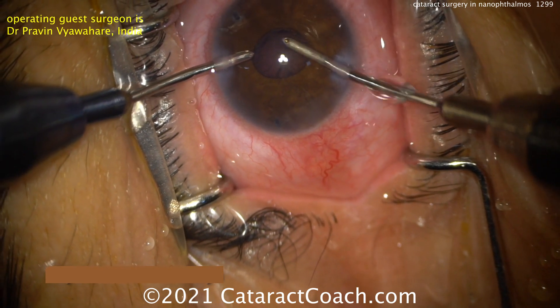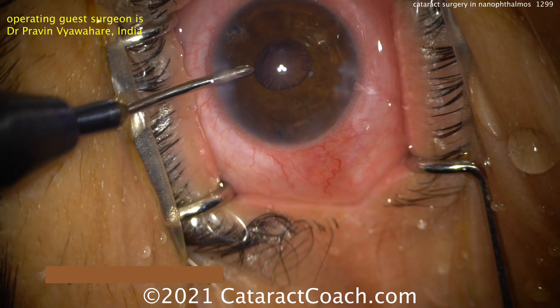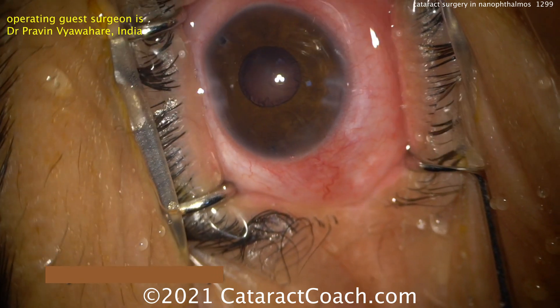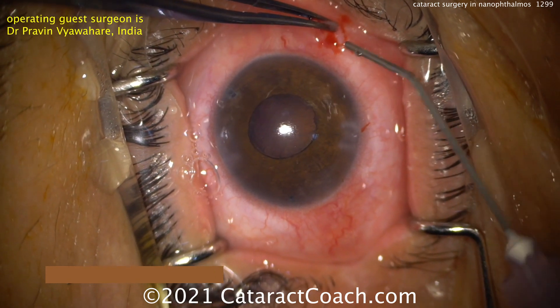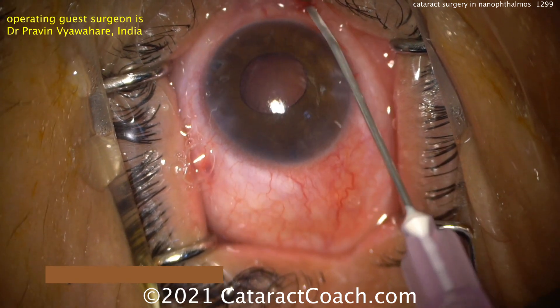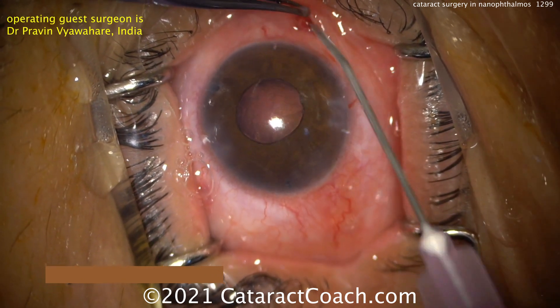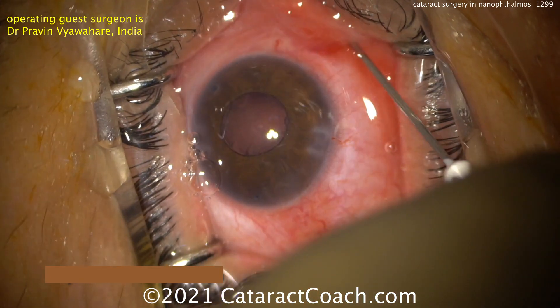He's using a bimanual approach — I like that he took a little break there, maybe didn't have the appropriate instruments at the time. Now the bimanual approach is going to make it a lot easier. What's he doing here? It looks like some anesthetic is going into the sub-Tenon's space, and okay, we're going to do an additional procedure — a sub-Tenon's block.